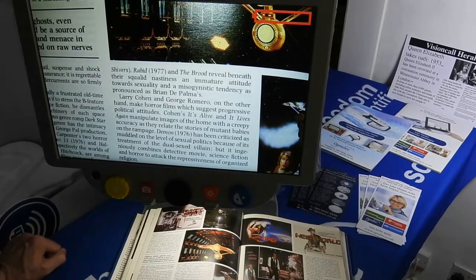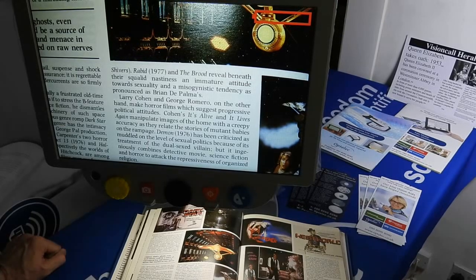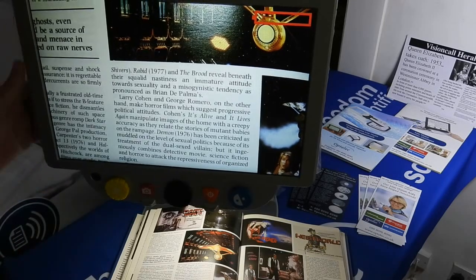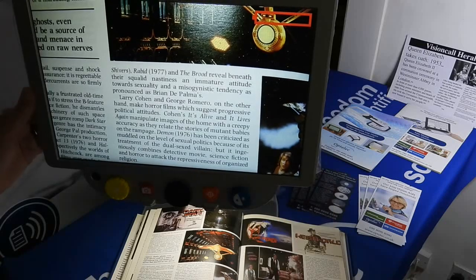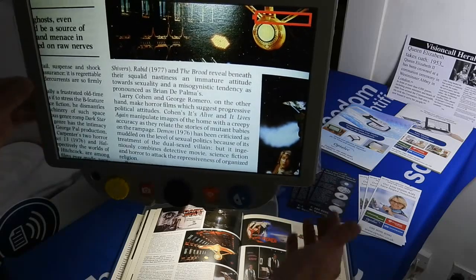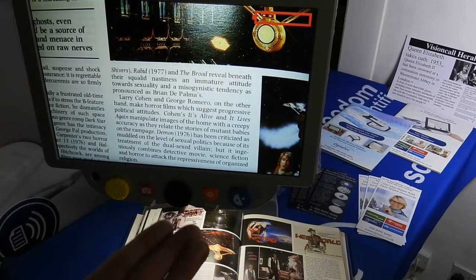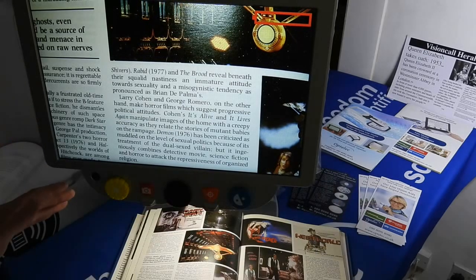Hello and welcome to another Enhanced Vision product demonstration. Today I'd like to introduce you to the Freedom Scientific PHD, which is part of the Topaz range. The whole idea of this machine is that it looks, feels, and works like a full desktop unit.